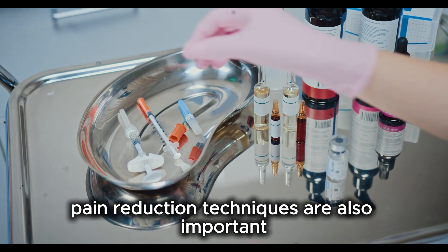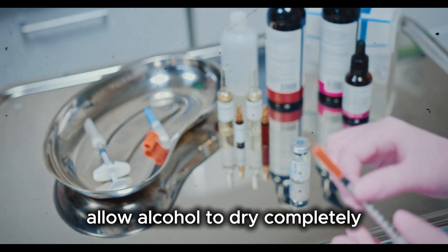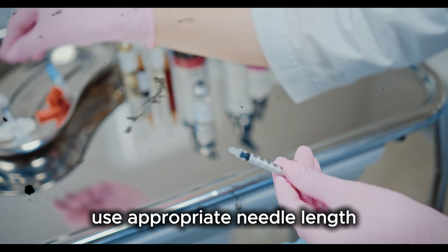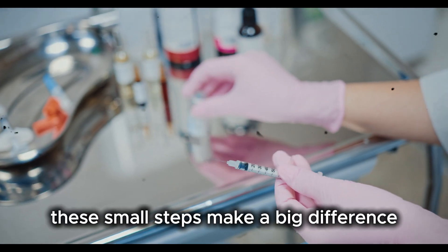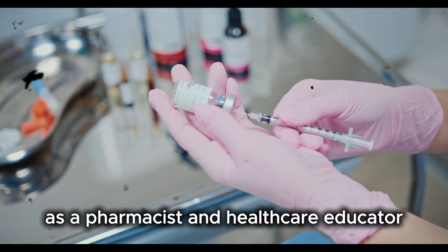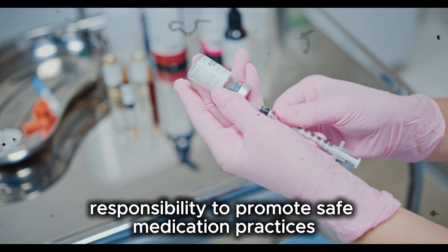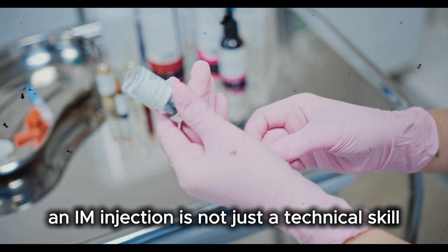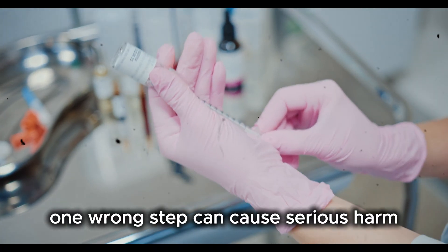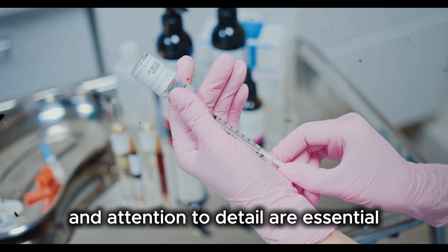Pain reduction techniques are also important. Use a quick dart-like motion, allow alcohol to dry completely, distract the patient with conversation, and use appropriate needle length. These small steps make a big difference. As a pharmacist and healthcare educator, it is our responsibility to promote safe medication practices. An IM injection is not just a technical skill but a responsibility. One wrong step can cause serious harm. That is why training, practice, and attention to detail are essential.